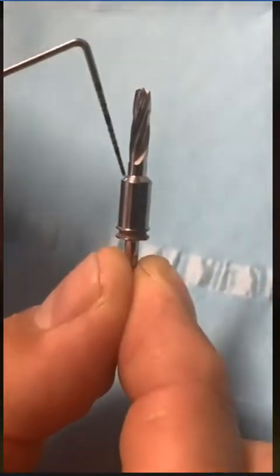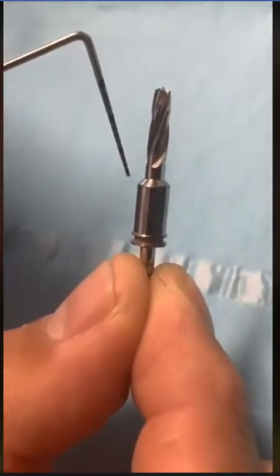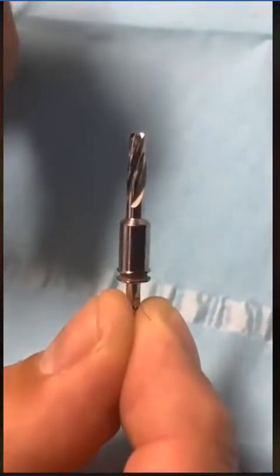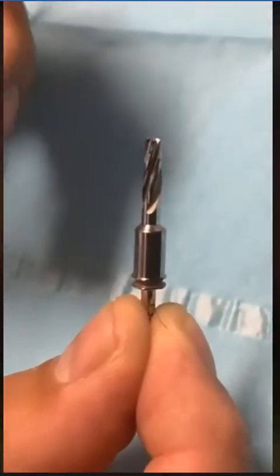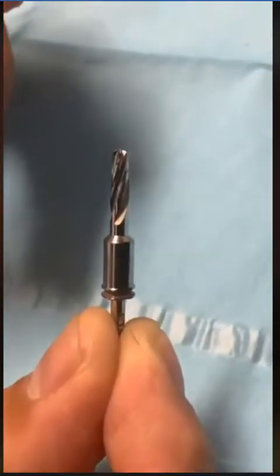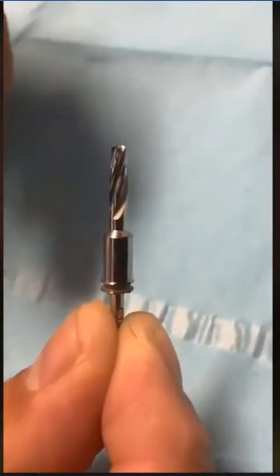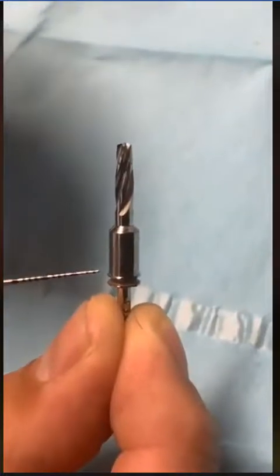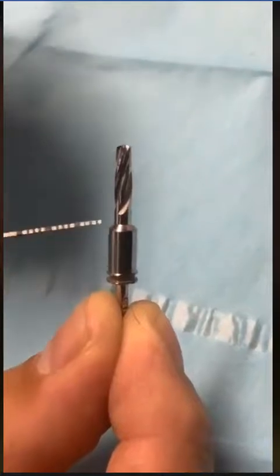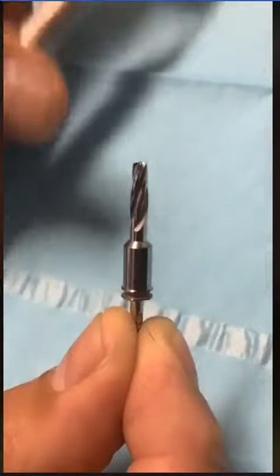Now, this is the area where the computer generates your coronal apical position of an implant on every single case, on every single implant size, if you will. Whether you're putting an 8mm implant, whether you're putting a 13mm implant, that calculation coronal apically is made through the computer onto your guide.